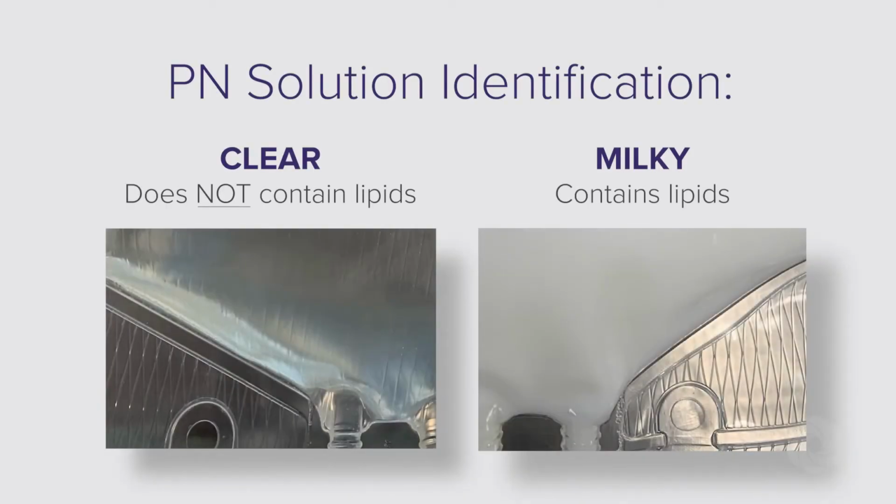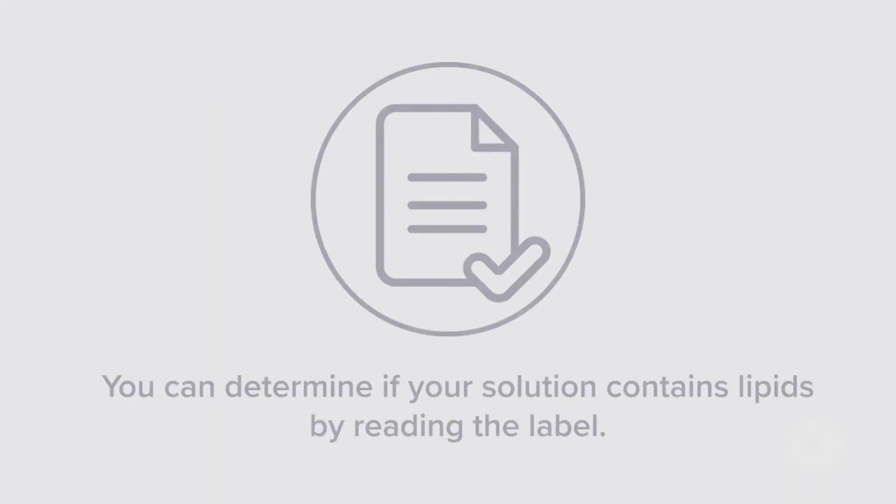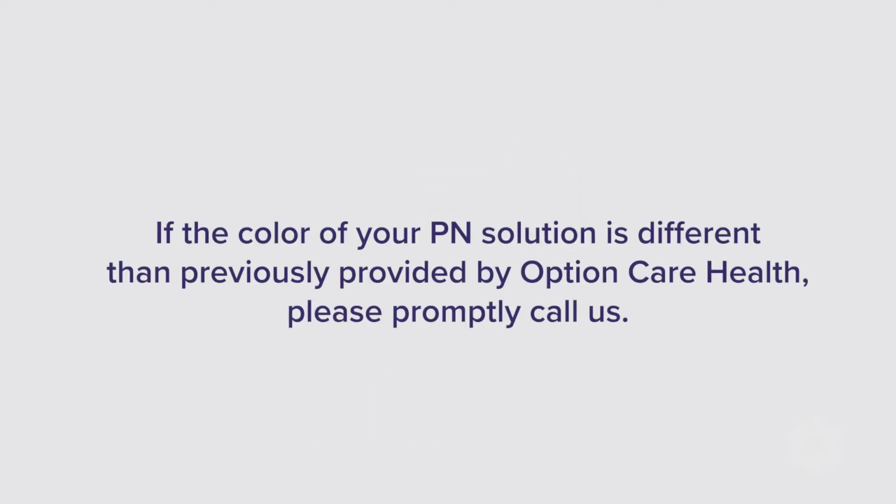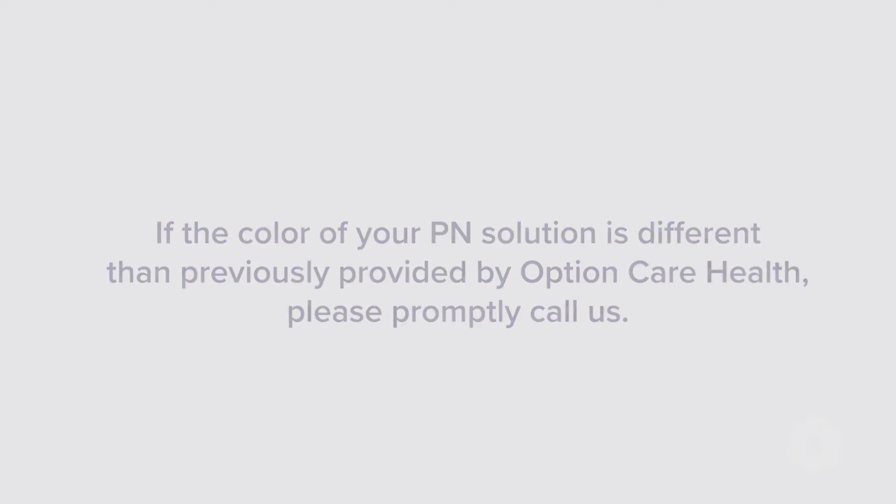Carefully observe the color of the PN solution. PN solutions will be clear if it does not contain lipids, or milky if it contains lipids. You can determine if your PN solution contains lipids by reading the label. If the color of your PN solution is different than previously provided by Option Care Health, please promptly call us.